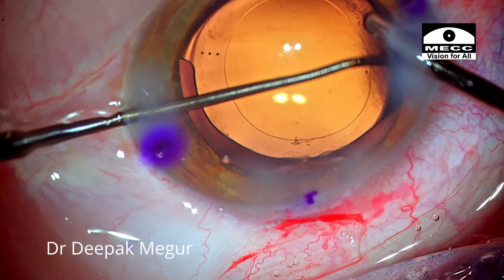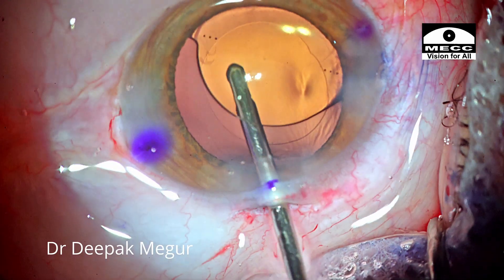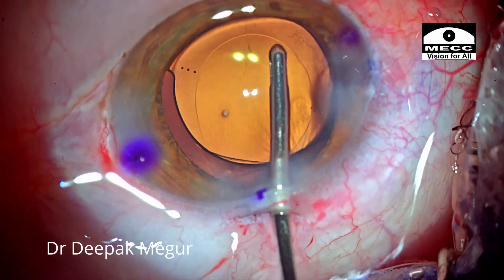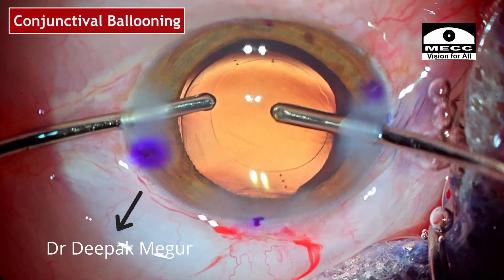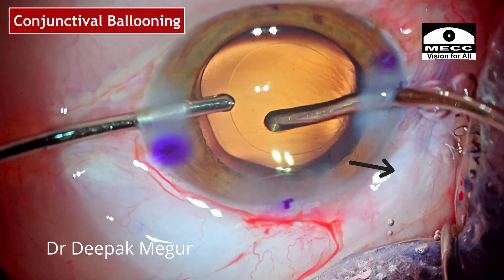The same thing is repeated on the other side. Remaining viscoelastic possibly sticking onto the lens is removed by irrigating the undersurface of the lens. There is a significant amount of conjunctival ballooning seen here, which is a little bit irritating, and it happened because of the posterior incisions.